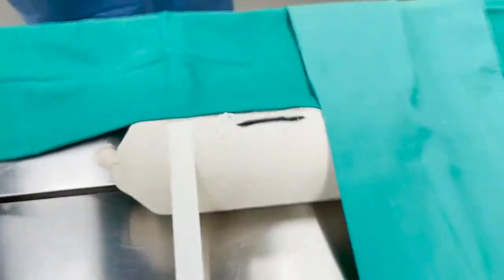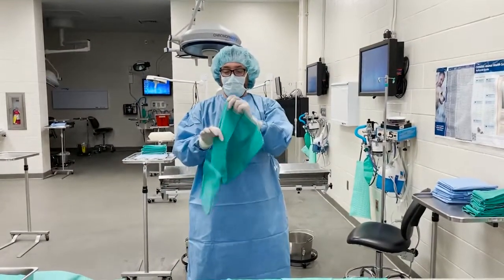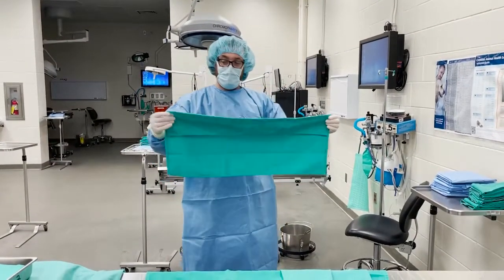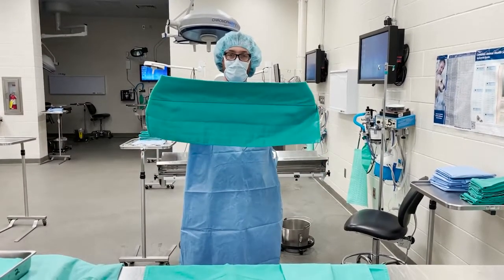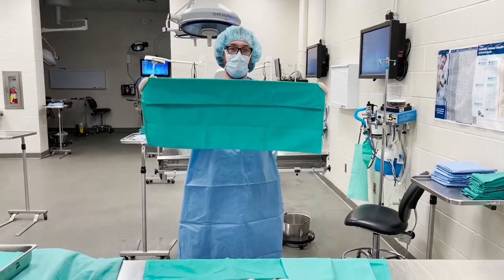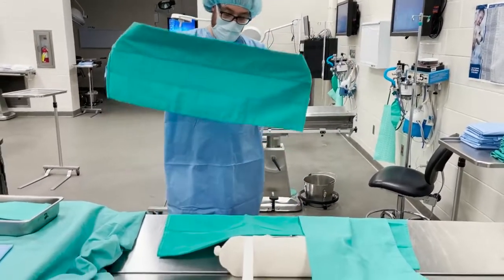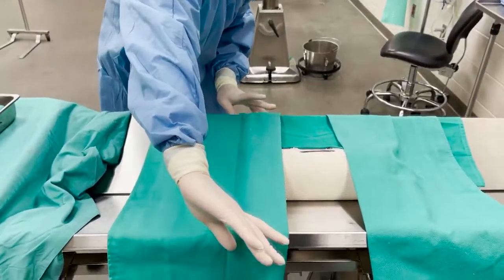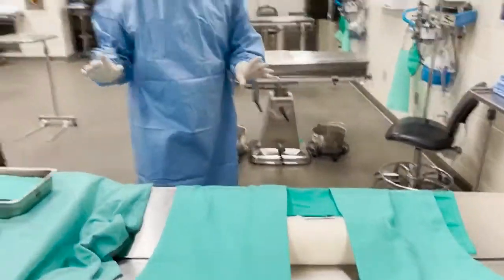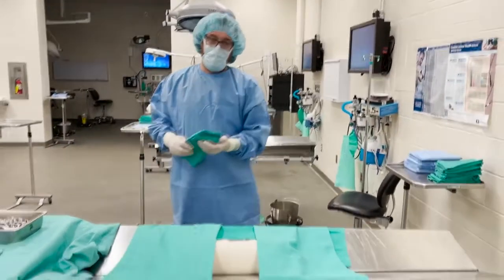The caudal towel is done the same way. Pinch, rotate, fold — you can see my fingertips and then when I do my fold they disappear. You don't want any fingertips exposed. With my right foot forward, I can place that without breaking sterility.